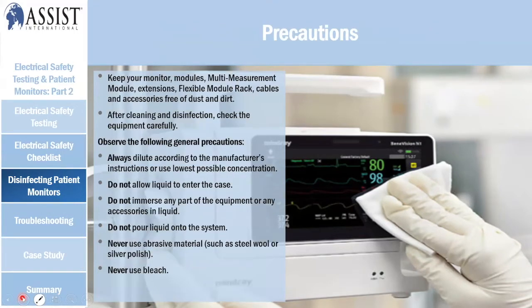Precaution: keep your monitor modules, multi-measurement modules, rack, and all cables free of dust and dirt. After cleaning and disinfection, check the equipment carefully. Check for any wet spots and wipe them properly.